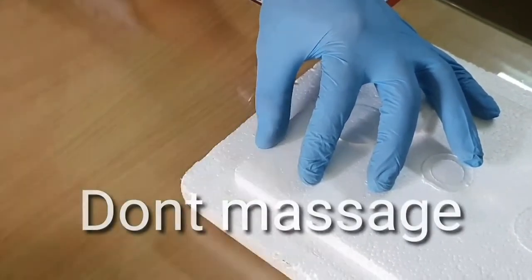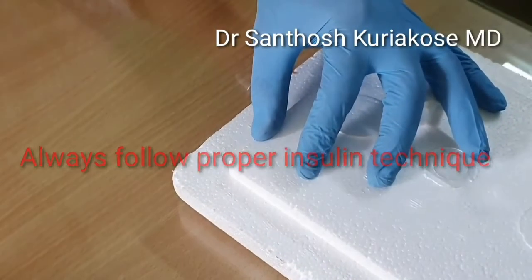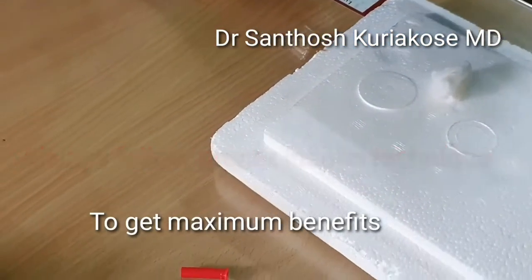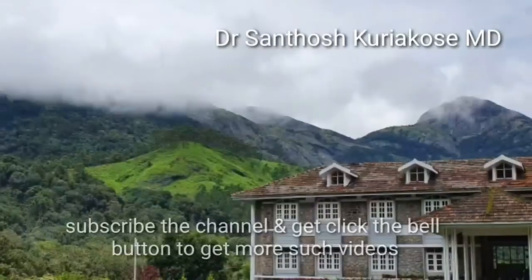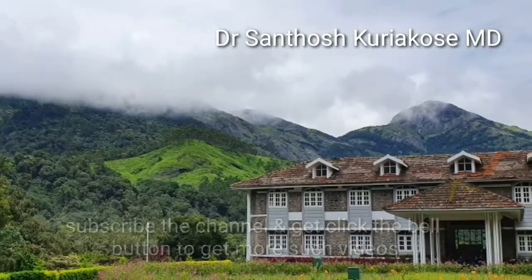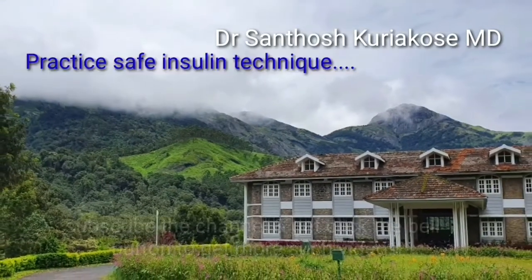So this is the way you follow to inject insulin using a syringe. Hope this was helpful for you. Always practice good insulin techniques. Thank you.